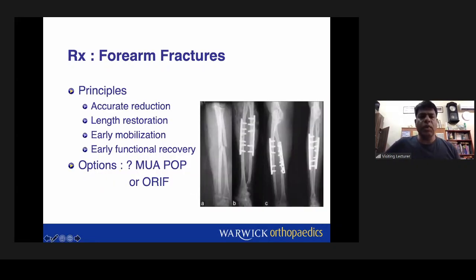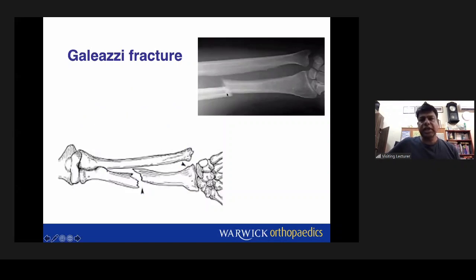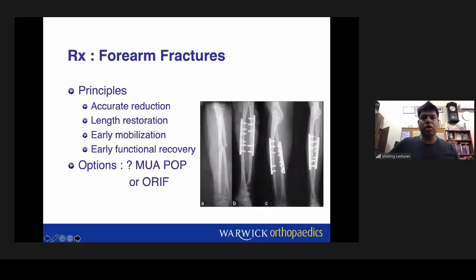I don't think you need to know about it, but what is important is when you suspect a fracture like that, you have to take the bone above. I told you the main principle. There may be a dislocation here because the mechanism is very strong. Just taking this x-ray is not enough. You have to get the joint above and joint below and the whole bone. So the elbow joint, the proximal part of the radius and ulna all have to be taken when you see something like that. So if you're a house officer, you need to order all these x-rays. These are classic examples of forearm fracture. They have all been treated by surgery.